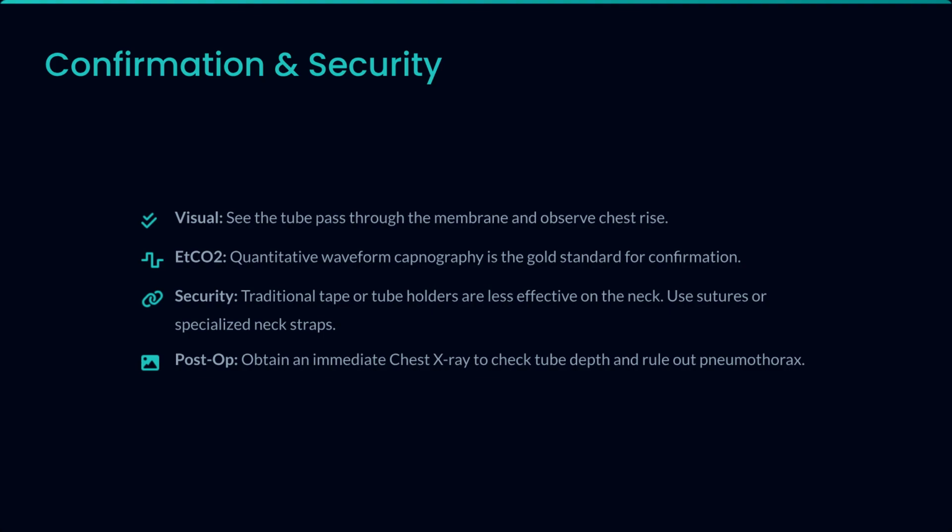Confirmation is achieved visually and with quantitative waveform capnography. For security, use sutures or specialized neck straps. Post-op, obtain an immediate chest X-ray to confirm tube depth.